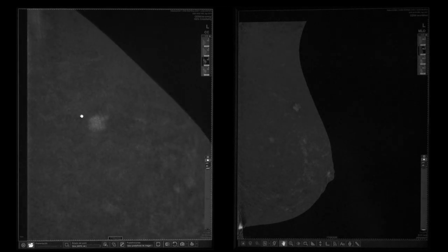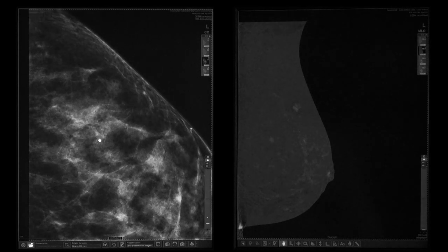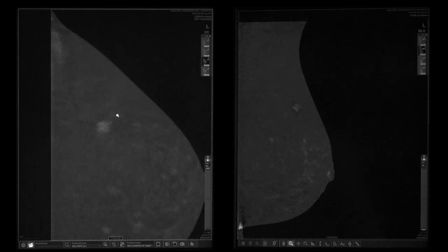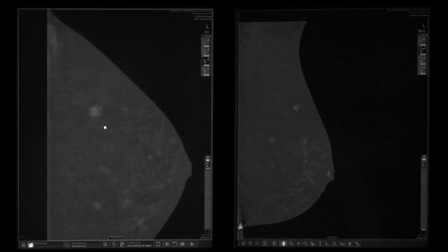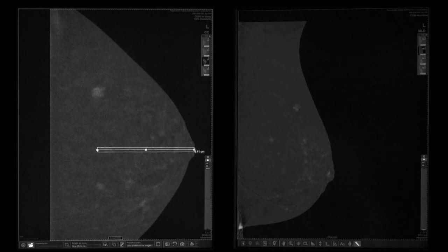Each of the following questions should be discussed. What is the location of the lesion? This will determine the approach and patient positioning. What is the thickness of the compressed breast? A vertical approach might not be possible if the thickness is not suitable. Shall the patient be sitting or recumbent? Is it necessary to use a spacer to lift the breast from the detector?